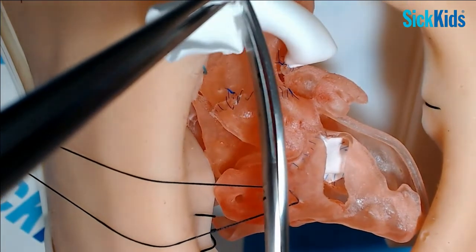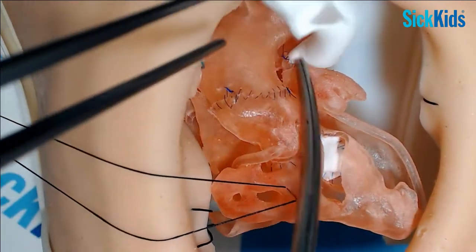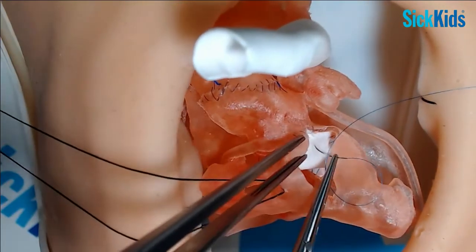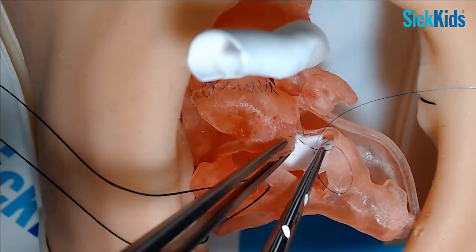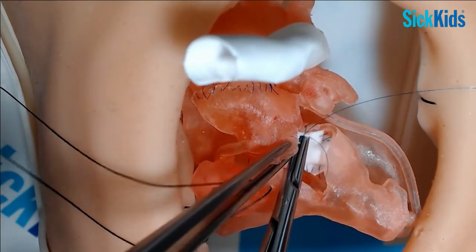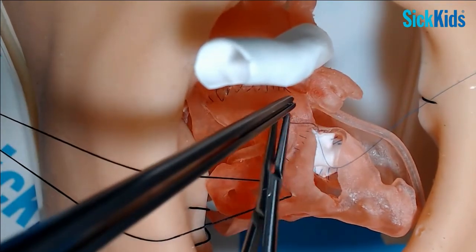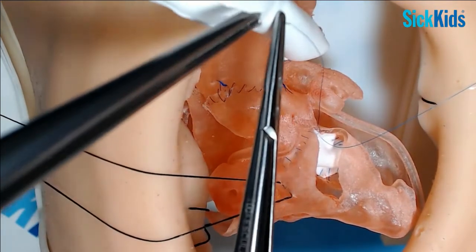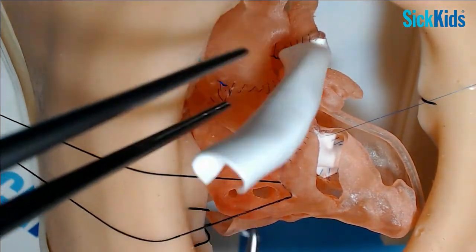A little bit shorter. Okay. What have we got? We've got 6 again. And again, so here you see you can actually pick up your patch. There's extra security to really seal off the top of the VSD.